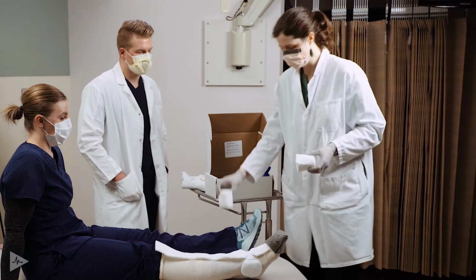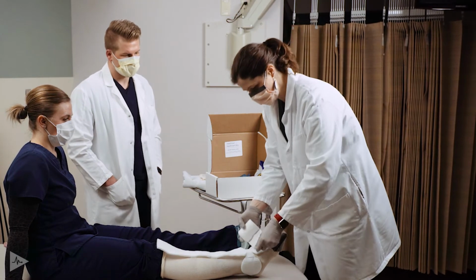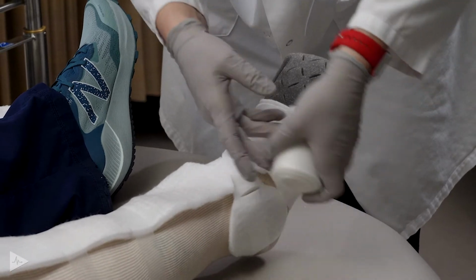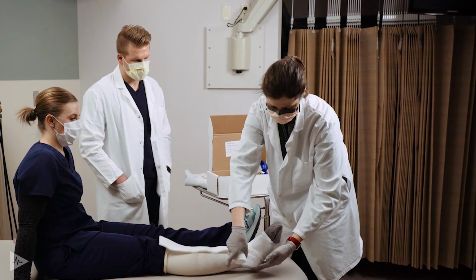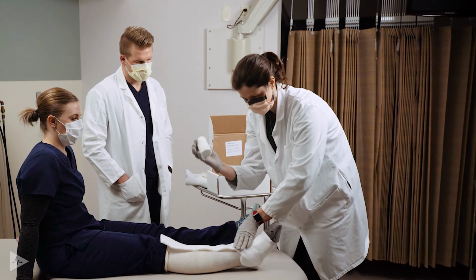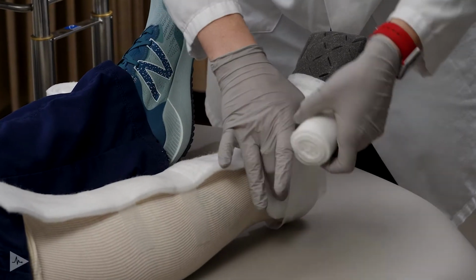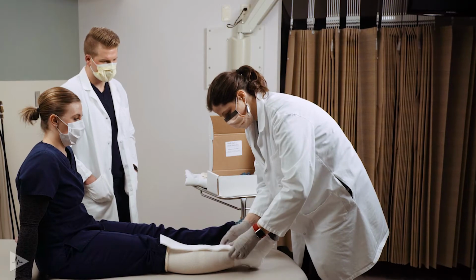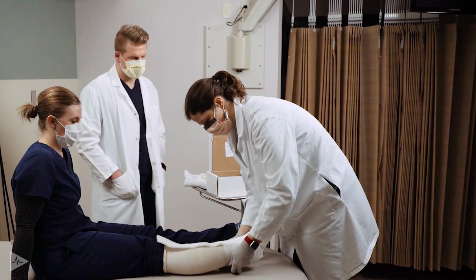Next will be 2 pieces of cotton batting for added protection around the foot and leg. And you'll just begin rolling those proximal to the foam padding for the toes. I'm trying to avoid getting significant creases. So with that cotton batting, if it's having trouble conforming, you can always just rip it and restart. Always try to get a uniform unit over the heel and ankle area. And then as you continue up the leg, you can usually just roll that continuously.